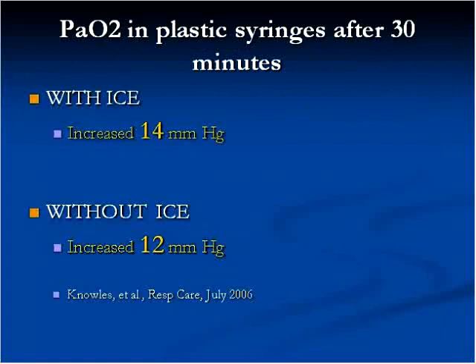When I first heard this information, I was totally shocked because I thought we iced the sample to slow metabolism, which would consume oxygen. Well, we have since realized that the plastic syringes do allow for oxygen to come from the room into the sample and contaminate it.